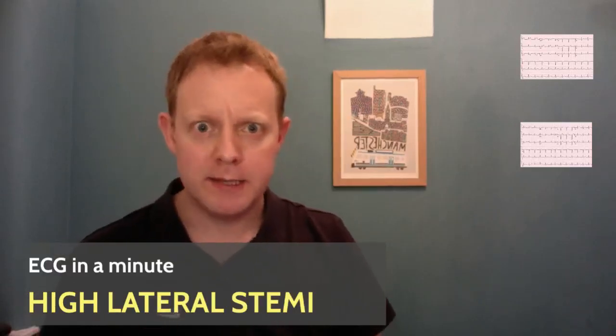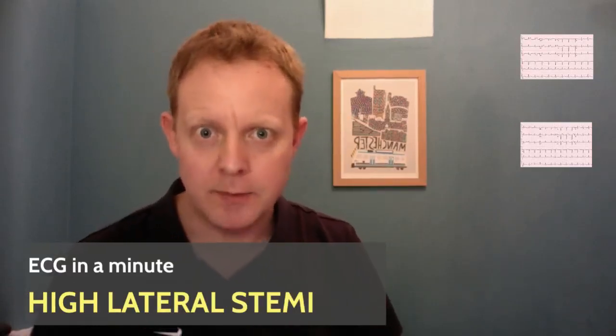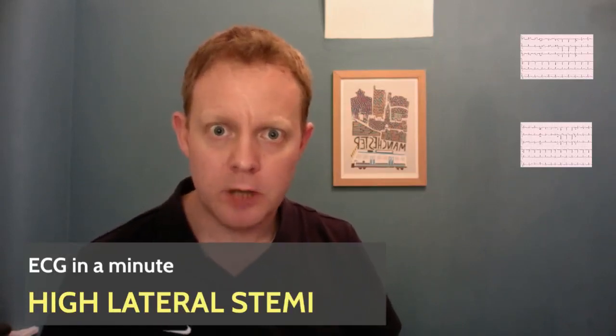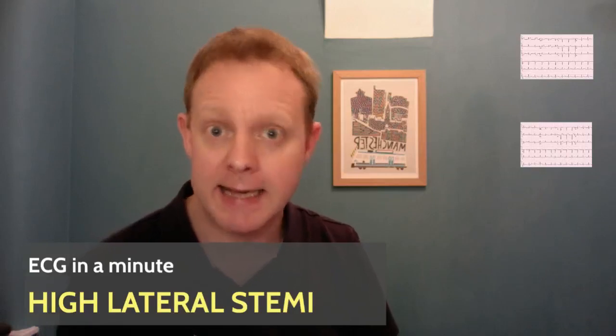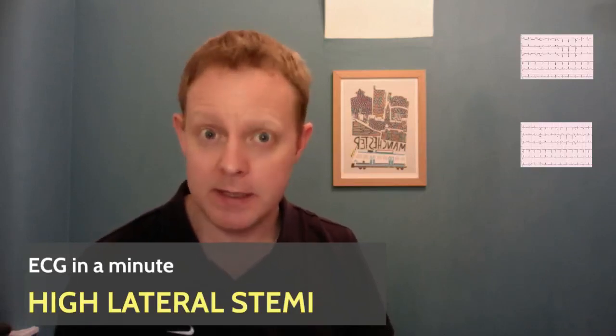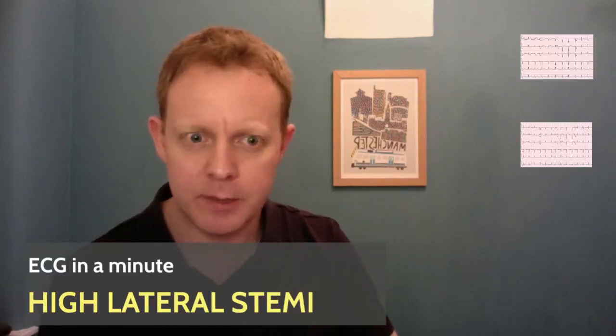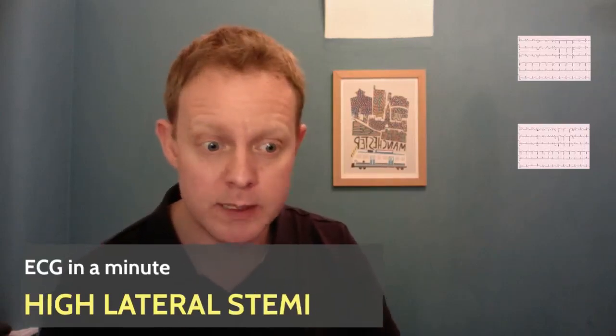Hello and welcome to this ECG in a minute video where I'm going to talk through two ECGs very quickly with one commonly missed abnormality, and that's high lateral STEMI. So at the end of this, you won't miss a high lateral STEMI ever again because I'll show you exactly the principles you need to be sure that you always spot it.